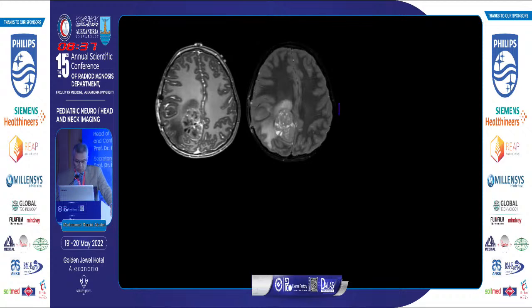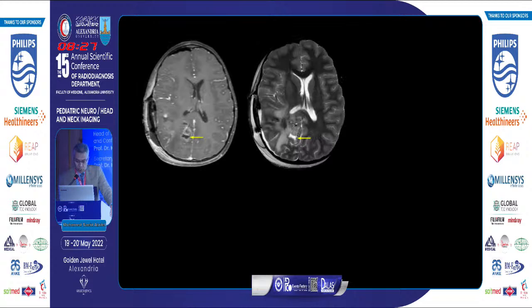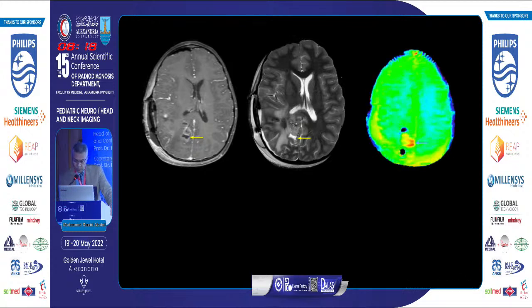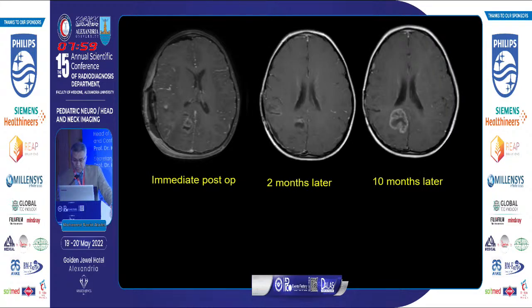A young patient with Ewing's sarcoma developed a brain metastasis showing high signal on amide proton transfer. Post-operative MRI revealed abnormal enhancement at the operative bed, and amide proton transfer demonstrated high signal consistent with tumor residual. The neurosurgeon was not convinced and requested conventional MRI follow-up. At two months and eight months, the lesion had evidently increased, confirming the initial diagnosis of tumor residual by amide proton transfer.